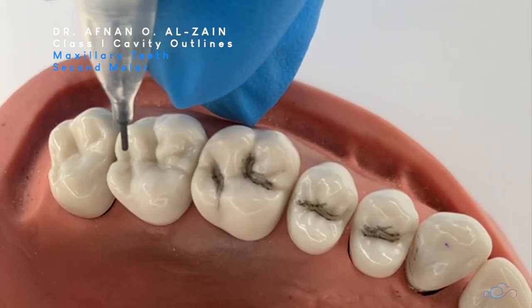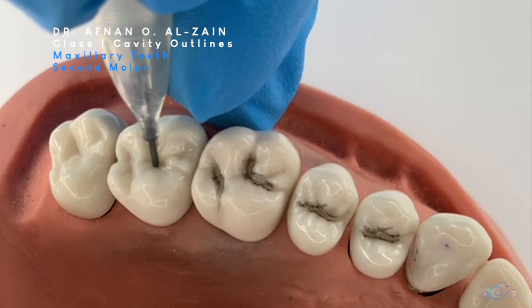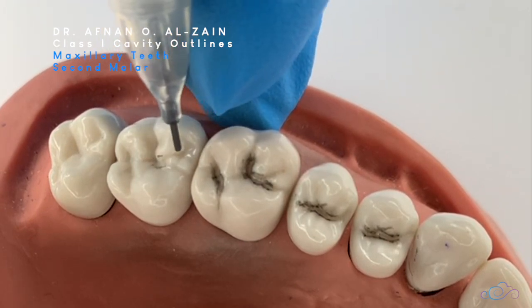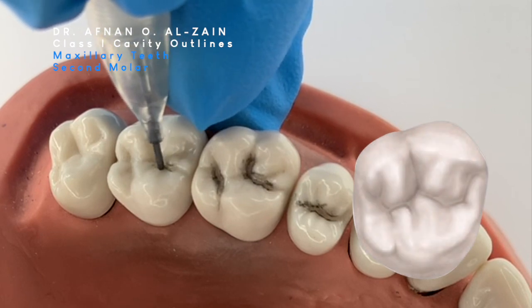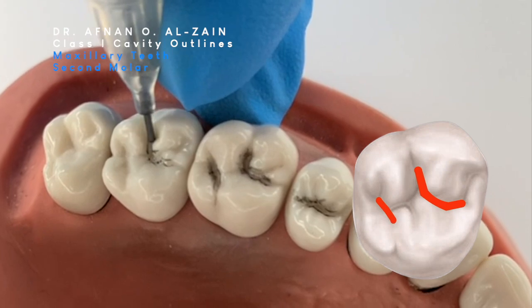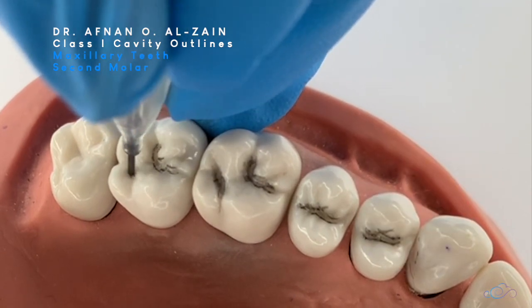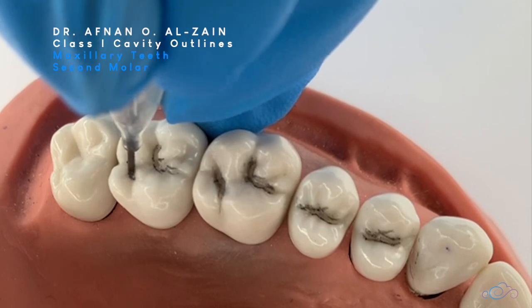Moving on to the second molar, or upper seven. It is going to be a similar outline to the six, except that it is smaller because the dimension is smaller. We make sure we don't go to the supplementary groove — we want to be in the main grooves. Similarly, we start from the mesial going to the center, going to the buccal. Moving on to the distal, it is the same thing — we go to the distal groove and draw our outline. So this is the outline for the maxillary teeth.